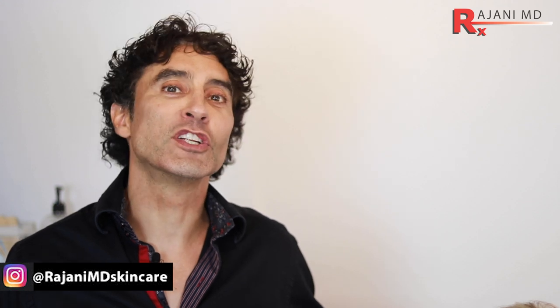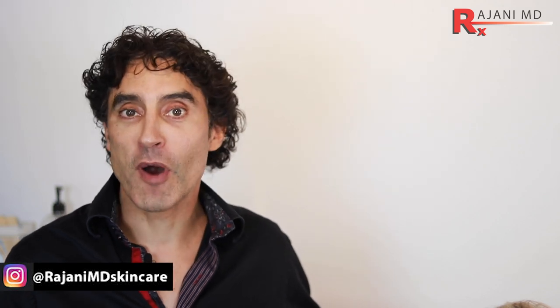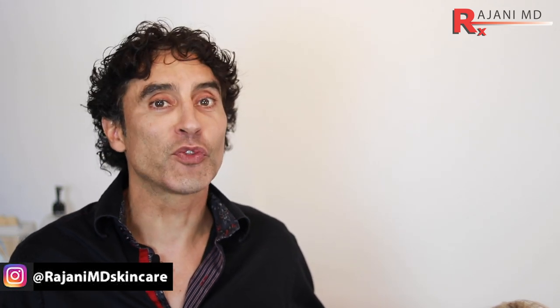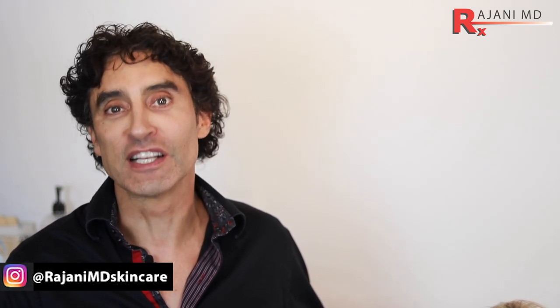Hi, I'm Dr. Ajani. Today we're going to do a brow lift. As I always talk about, it includes typically temple filler, neuromodulator to lift, and PDO threads. In this case, we have a nice full temple, so we're going to do the neuromodulator and the PDO threads. Let's go watch it.